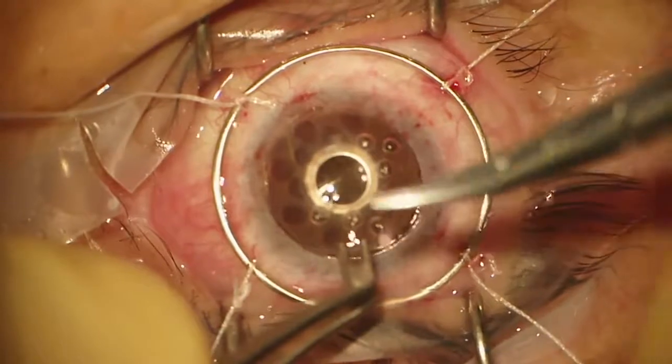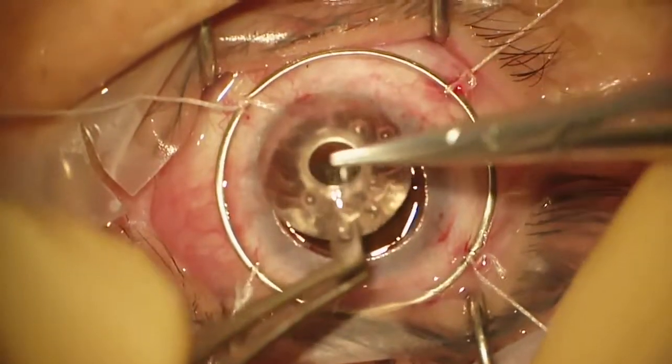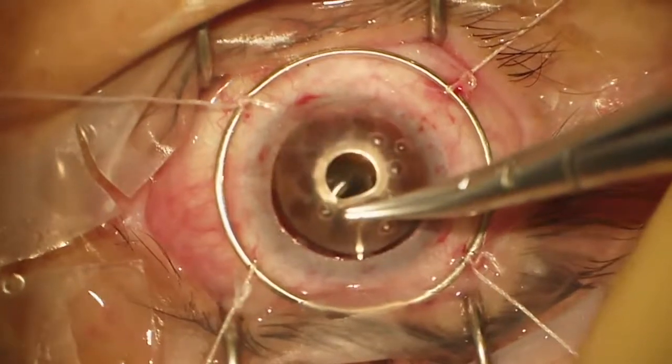Excuse me, Dr. Mannis. Yes. Should we do PI or not? I normally do not, but you certainly could do that. If I do that, I'll do an inferior PI.